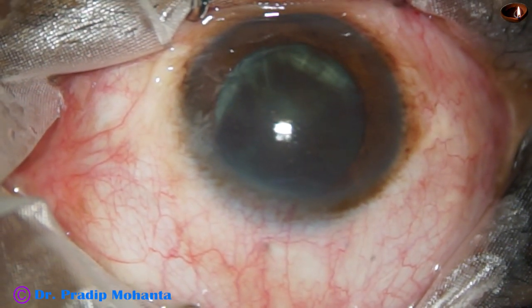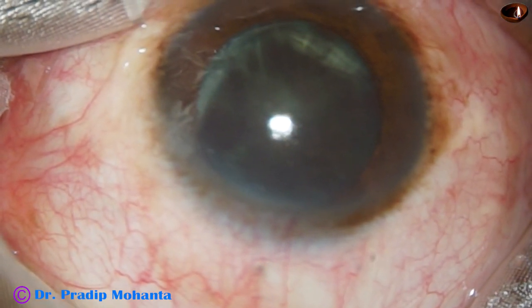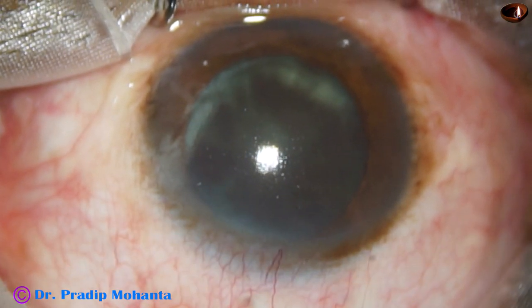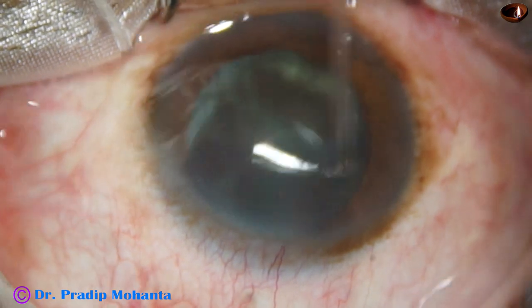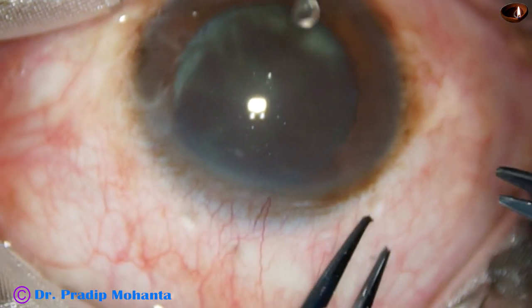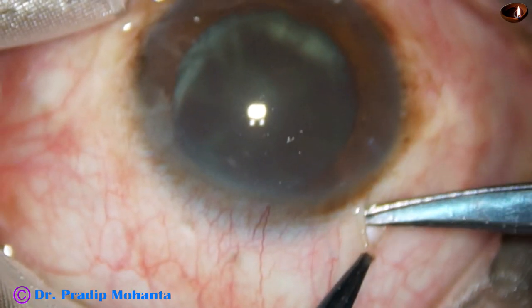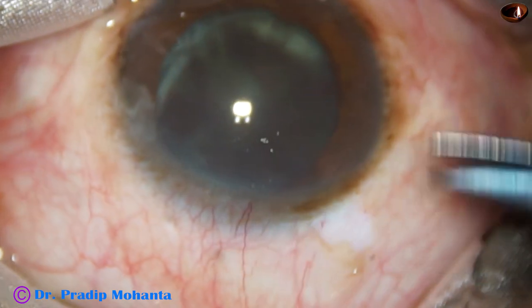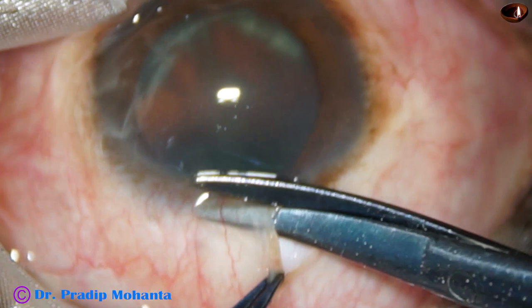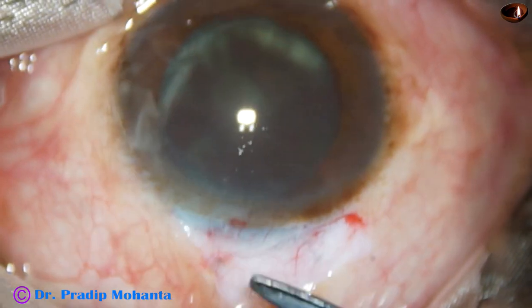Now we go to a little higher magnification and we are going to start conjunctival peritomy. Since this is a soft cortical cataract, conjunctival peritomy is being done for only 2 clock hours, from 11 o'clock to 2 o'clock. Only conjunctiva has been taken.